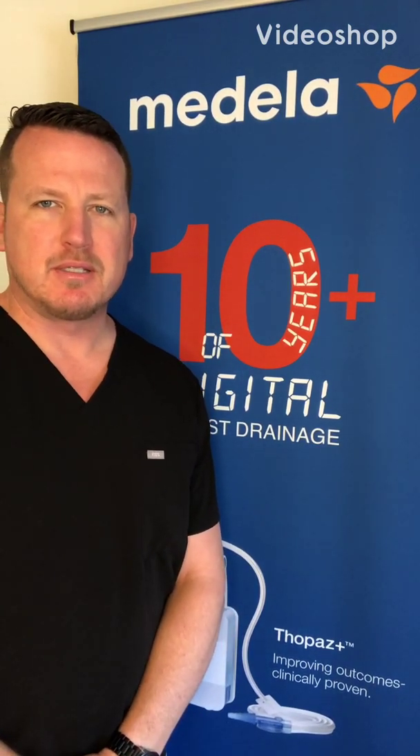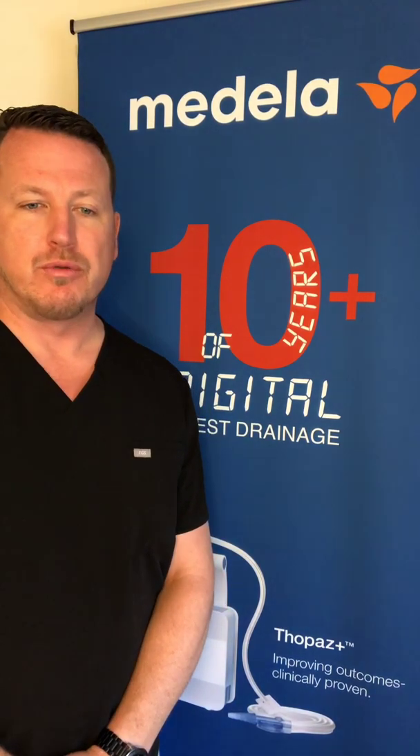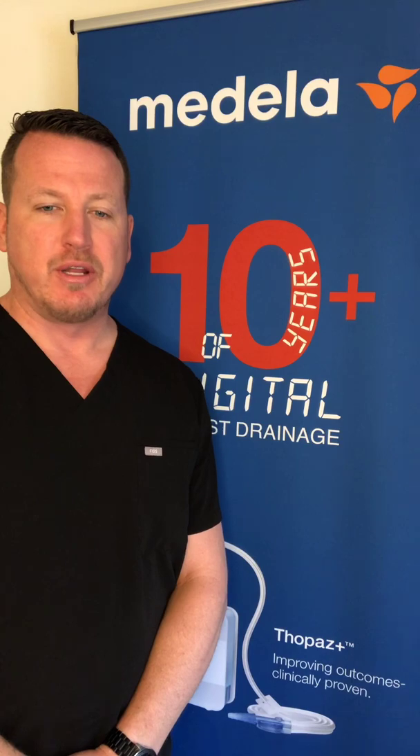Welcome to the Thopaz+ digital chest drainage system product demonstration video. In this video we will go through the system setup, starting therapy, therapy management, alarm management, and therapy discontinuation.